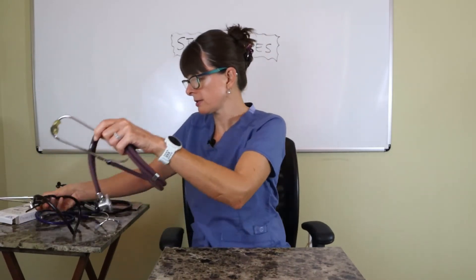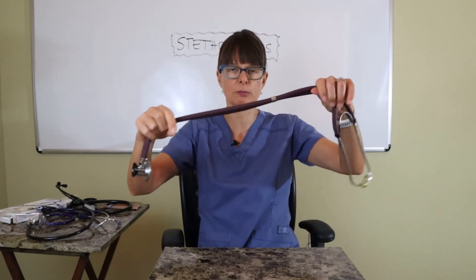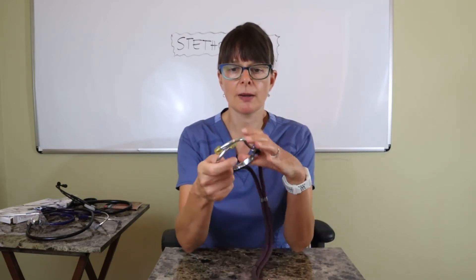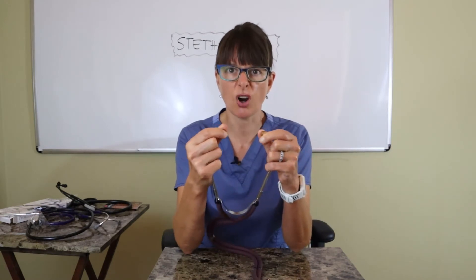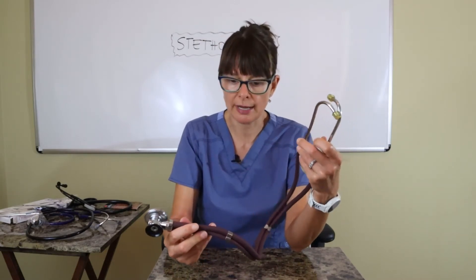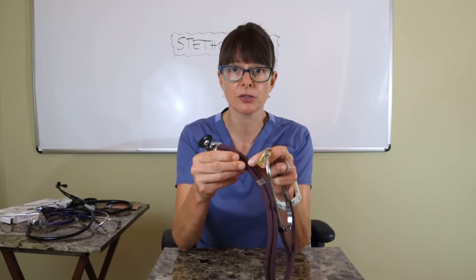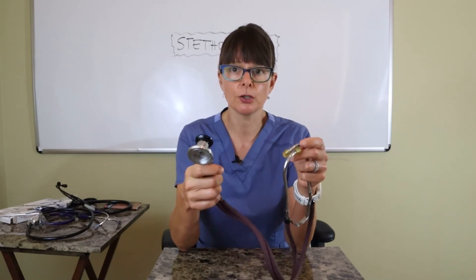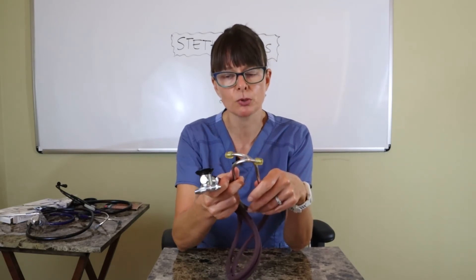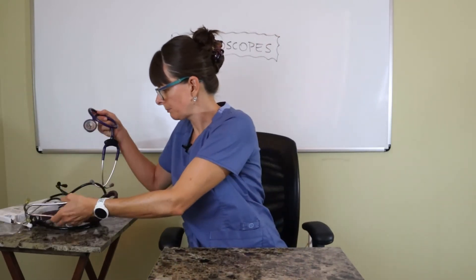Number two here is a dual stethoscope, which has two flexible tubes and also has a bell and diaphragm that are reversible. This one comes with harder earpieces, but you could swap them out. What I really don't like about it is the double tubing, because there's a chance the tubes can rub against each other and pick up extra background noise that makes it harder to identify patient sounds.